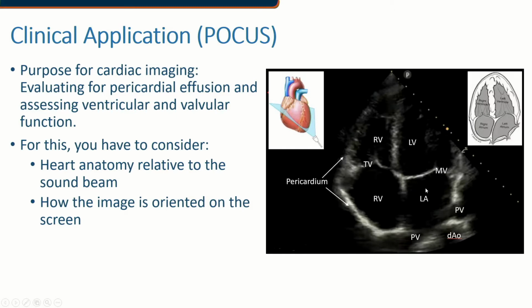And also you want to have your depth deep enough for you to even see those pulmonary veins. So that can be very useful too. And remember, from your parasternal long axis view, one of the things that told you where your left atrium was is that you could see the descending aorta deep to it because it runs posterior to it. So it's one of the last things that the sound beam encounters, and so you should be able to see that descending aorta in that same orientation to the left atrium, as you see it in its relative orientation even when you're doing a plax exam.